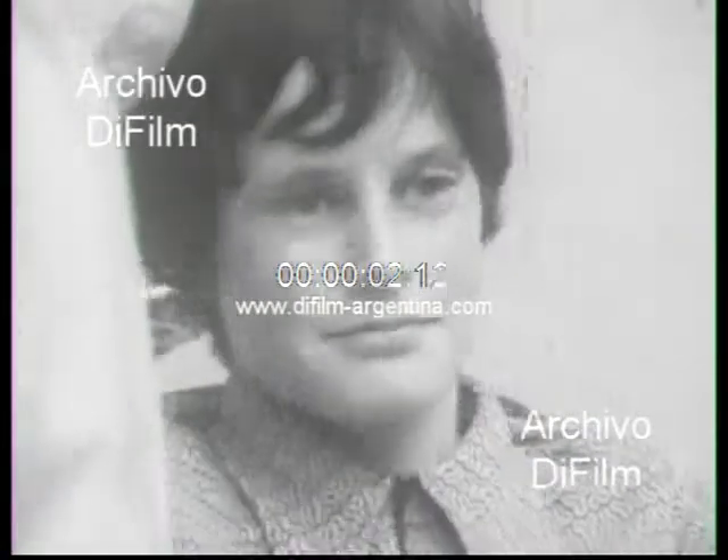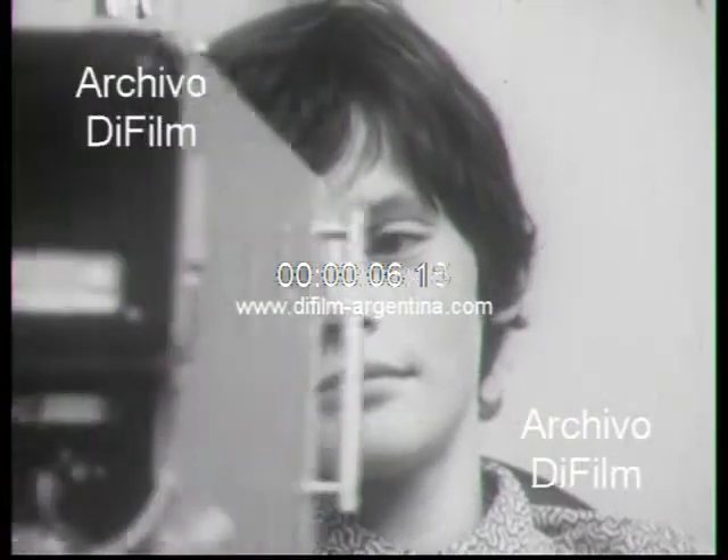All right, son, we're going to take some pictures of your teeth now so that we can determine whether you have any cavities or not, and whether you've been doing your tooth brushing well.